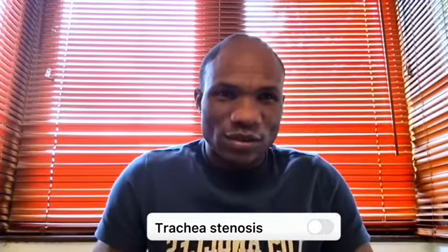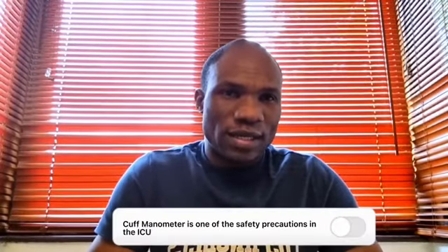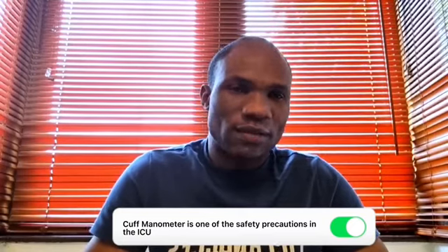It can cause tracheal necrosis, tracheal stenosis, hoarseness of the voice, even long after the tube has been removed. It can cause sore throat and other complications like that for the patient, which we don't want. So the cuff manometer is one of the safety precautions in the intensive care unit.